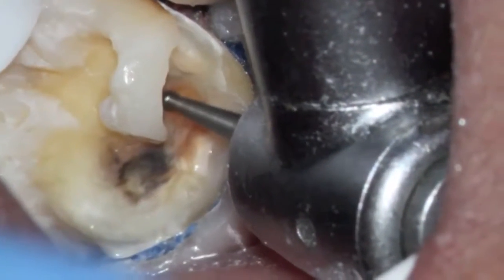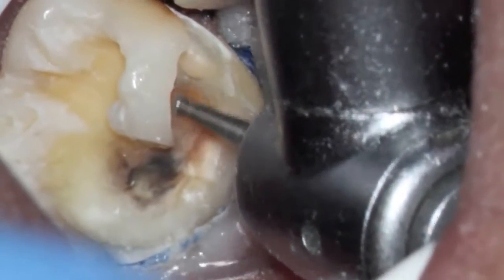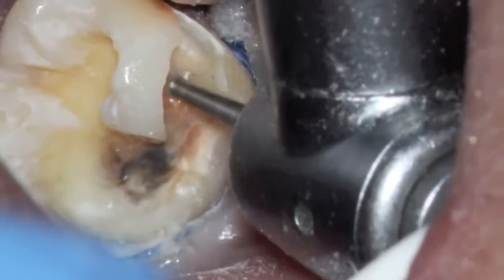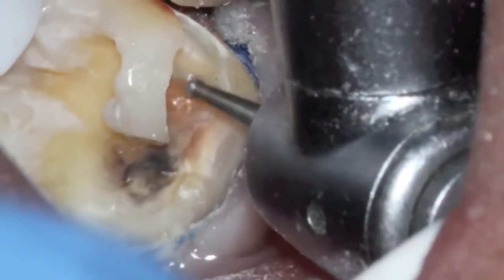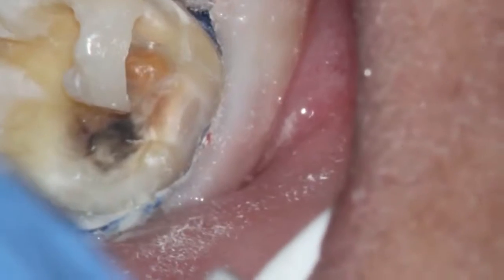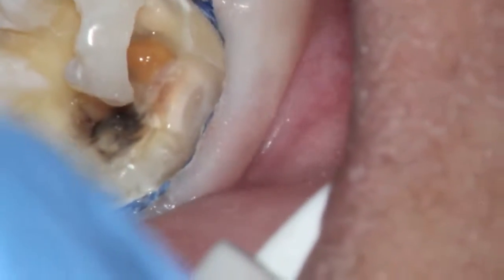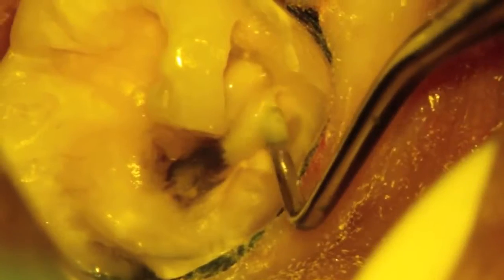Here we have the filling area still being cleaned up a little bit, but most of the decay is gone. Most of the brown area there is able to receive a filling without having decay underneath it. And we're going to go ahead and place a base underneath it. That's what that kind of cream color is, and that will help to encourage the tooth to lay down some more tooth structure between that and the filling.